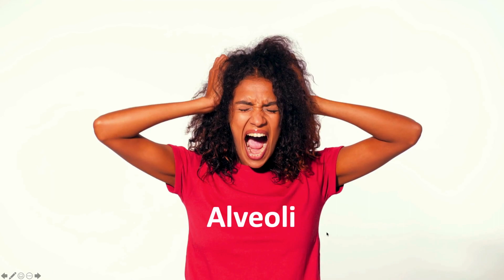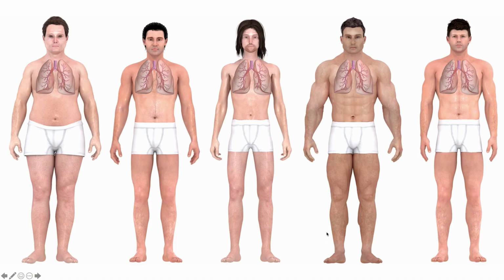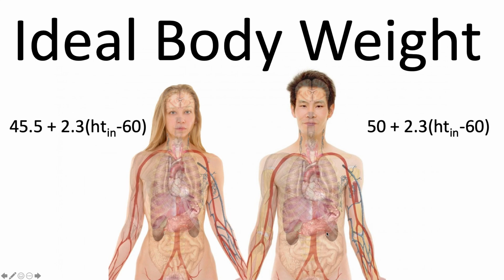These days, based on recent research, we're finding we need to put a lot less volume than we once thought we did. And the most important thing to hammer home and understand this is most of our lungs are the same. For adults, they're the same size. Just because there's a 100 kilo person and a 300 kilo person doesn't mean their lungs are different sizes. It actually comes down to the height of the patient. So again, it's not just the weight of the patient, it's the height of the patient. So that's when you need to start talking about ideal body weight. Now there's equations for this based on whether you're a male or a female, but you can see it's based on the patient's height.